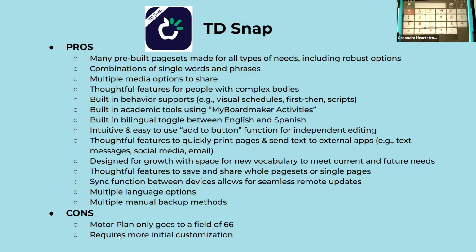You have multimedia options to share. You can share in here. You can share pictures in here. You can share videos. You can have videos that you took on the device. You can have videos linked to YouTube to just show a moment of a YouTube video in there.